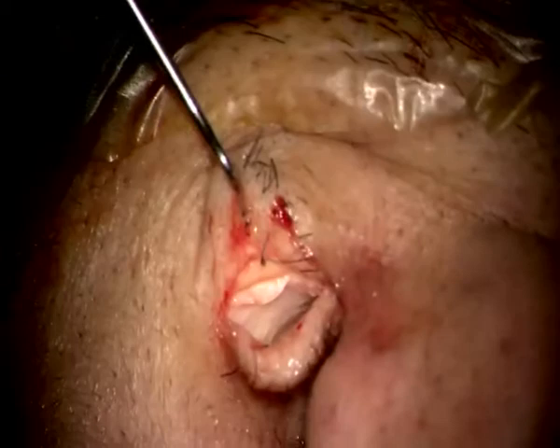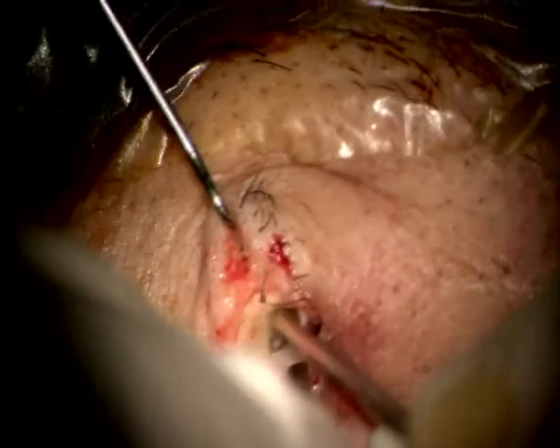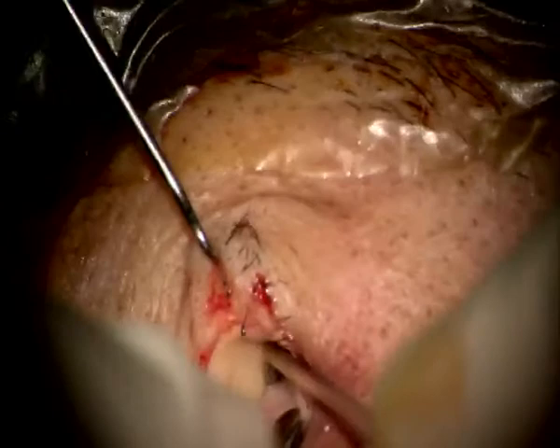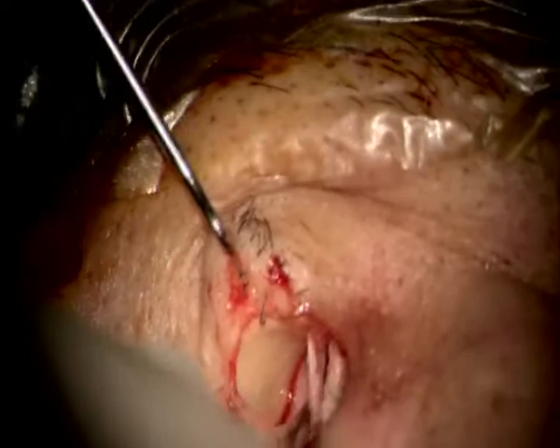And with everything in place, take out the perichondrium. Use a dull round knife. And suction.